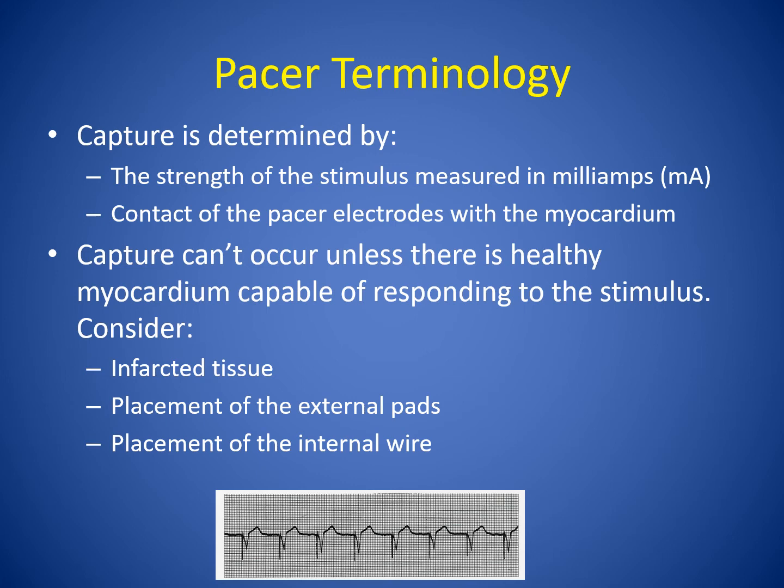So a pacemaker is not going to be the treatment for someone in PEA or asystole, because if there's no myocardium, it's not going to be receptive to impulse.